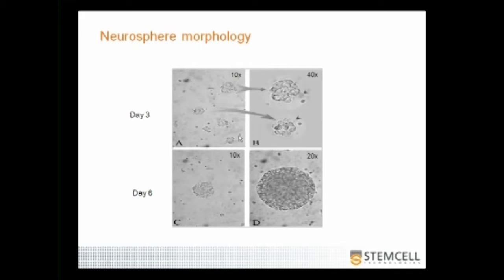As the clumps or neurospheres increase in size and density, they detach from the bottom of the dish and float in suspension. By day 6, the majority of neurospheres should be floating in suspension and be transparent spheres with round, intact peripheries. The cells within the neurospheres are phase contrast bright without any dark necrotic centers. At high magnification, you should be able to see small microspikes at the edges of the cells, and these are thin protrusions which act as feelers of the microenvironment in the media.